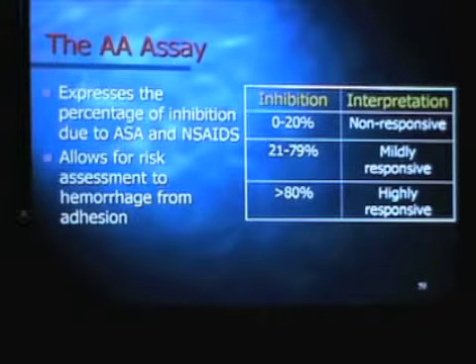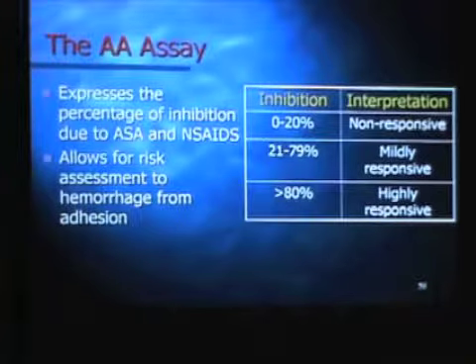My uncle had a dual stent put in at Kaiser, and he just happened to visit me, and about a week post-stent, I said, I want to do a TEG on him, platelet mapping. I found out that, first of all, his 75 of Plavix inhibited him only 12%. Wasn't working. And his 325 of aspirin had him 98% inhibited. Way too much. So I called his cardiologist and I said, do me a favor, take him down to 162. And then let's see where he's at.